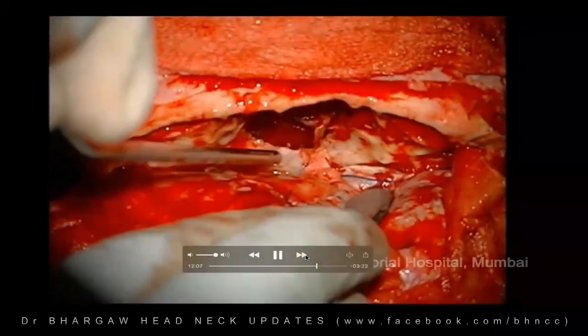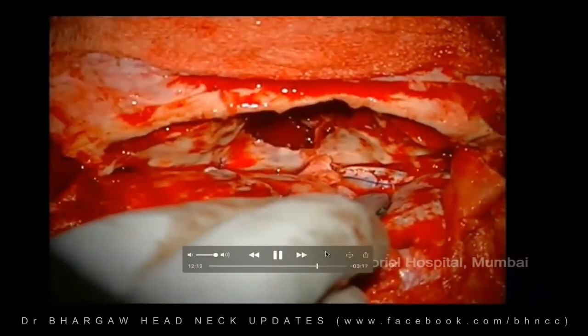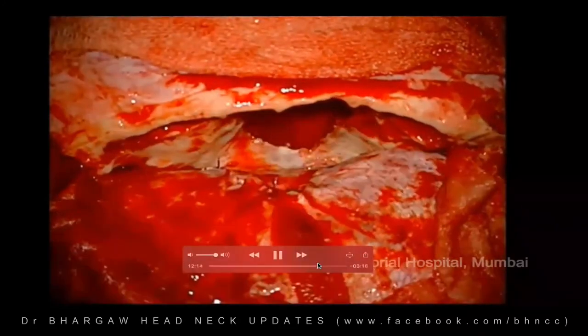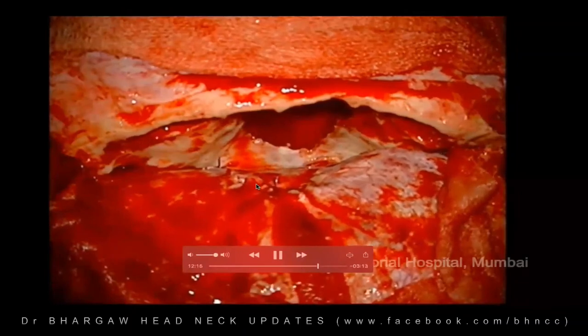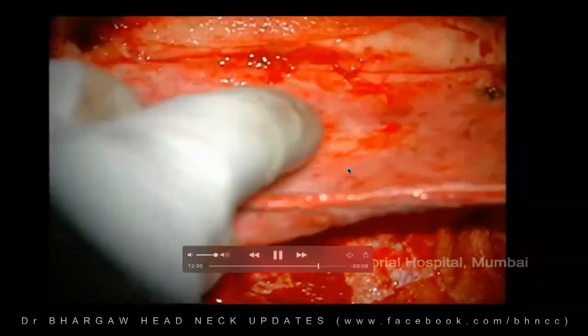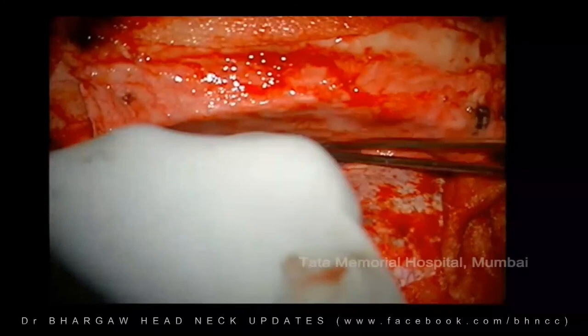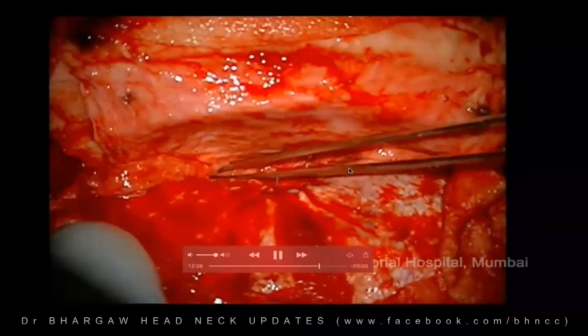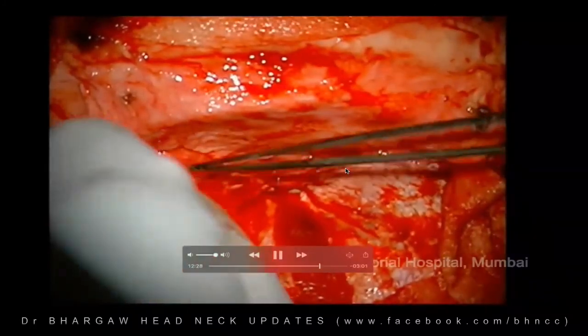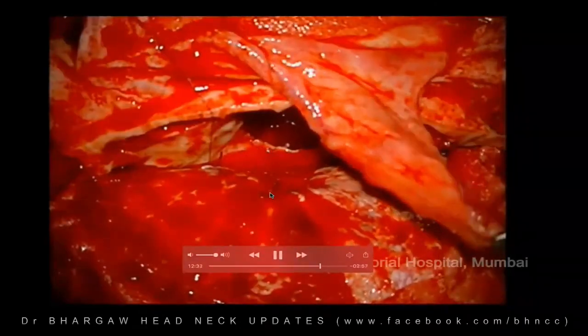So we're just trying to get that ledge of the mucosa for suturing the pericranial flap there. You see the pulsation that is there. Once you achieve a good seal, you'll naturally start getting that pulsation. So now the pericranial flap is being put down there, and that will be sutured to the edge of the dura posteriorly.